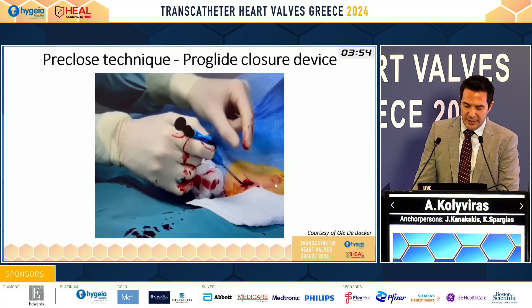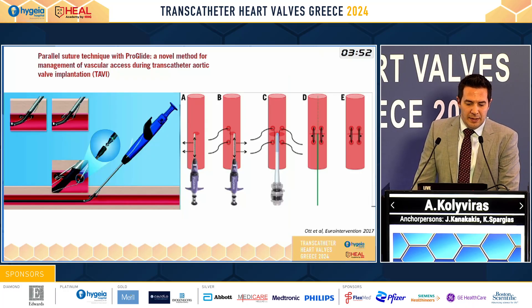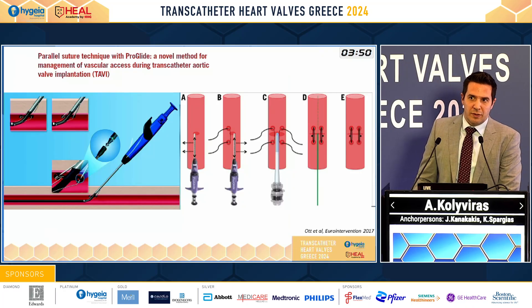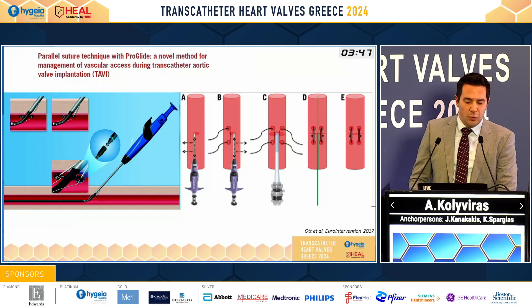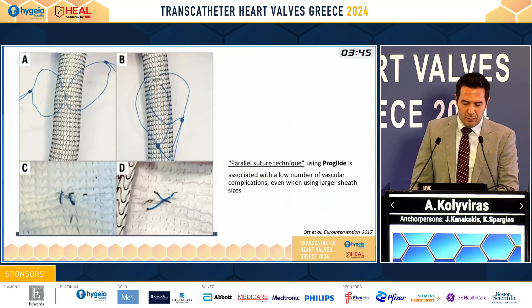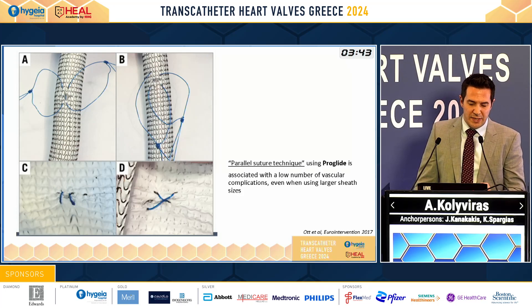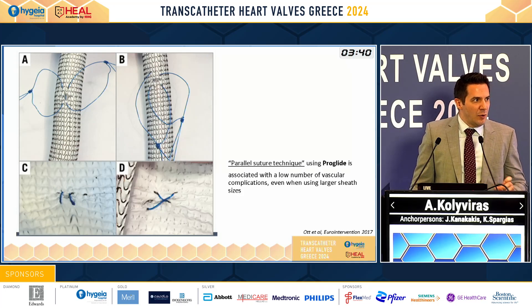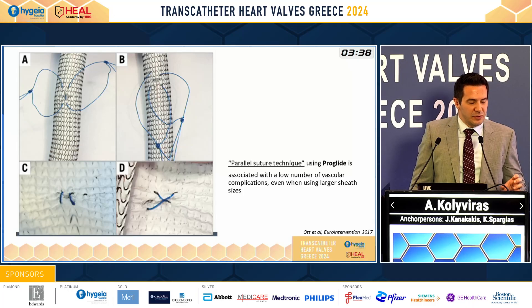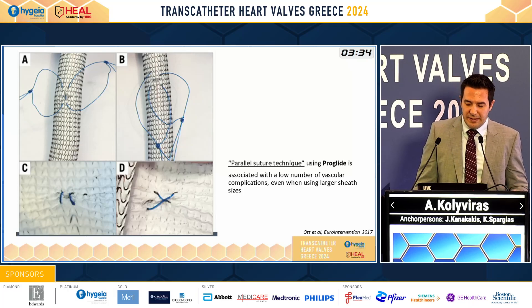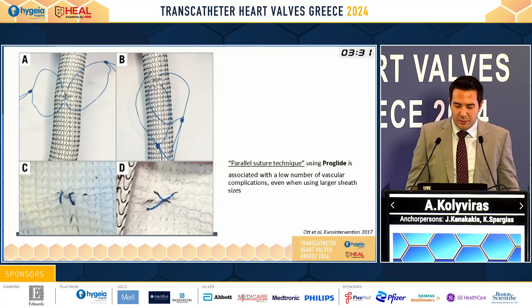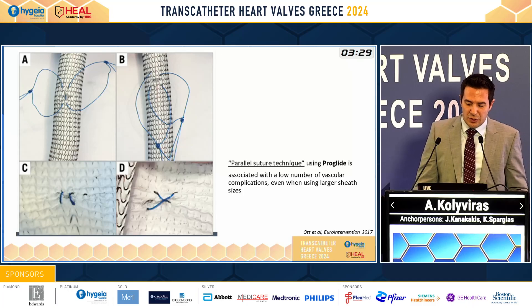This technique is at the beginning of our procedure. If we use a rotation of the ProGlide at 10 o'clock and 2 o'clock, we end up with a crossed suture. But our recommendation is to make a parallel suture technique — we don't have to rotate the ProGlide at the beginning, and with the parallel suture technique we have fewer vascular complications.